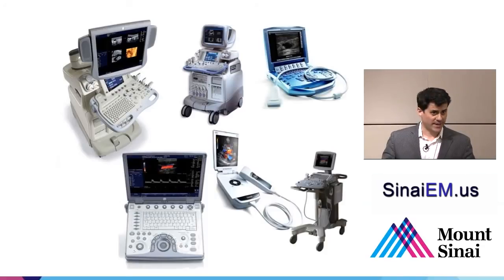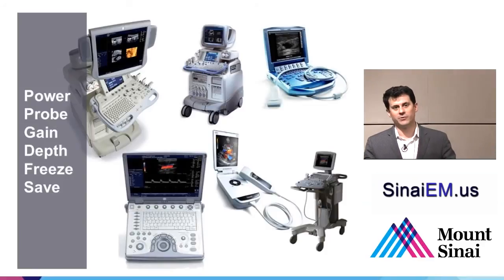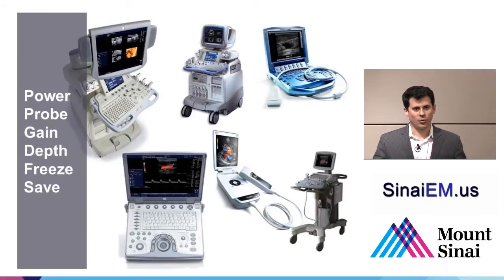And you either figure it out or you ask someone at your institution that's familiar with the machine, and these are the buttons to know. So take a moment and have a look at this, because any ultrasound machine in your institution is for your use as long as you understand how to use these. Unless it's not yours, then you shouldn't go to other departments and use their machine just because you know what the buttons do. You want to know where the power button is. That's pretty obvious usually, but figure that one out.